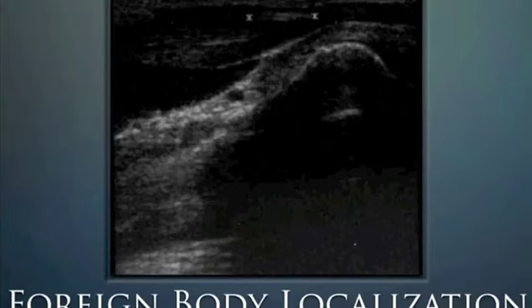This is a bone in the hand, one of the metacarpal bones, and over here we can see the toothpick. It's outlined by the two stars, and with these foreign bodies, it's important to inject lidocaine into and around the foreign body for 3 reasons. Number one, that helps to visualize the foreign body, because ultrasound loves fluid so much, it enables it to visualize the actual foreign body better. Number two, it helps to unroof it to make it easier to remove.